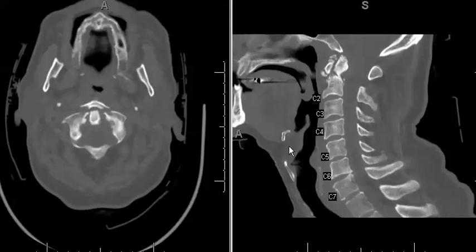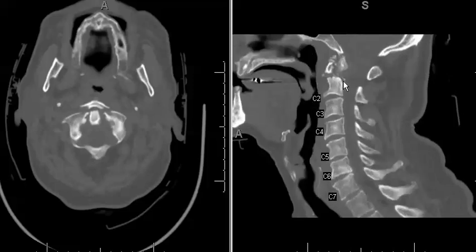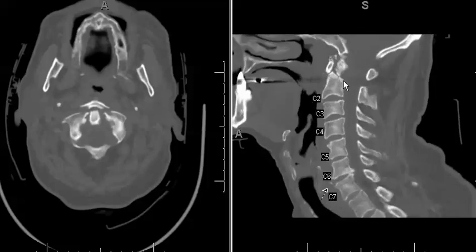These are axial and sagittal CT images of the cervical spine in a 62-year-old male status post-trauma. This case has several findings associated with it. Notice already scanning through the sagittals, there is prevertebral soft tissue swelling present.